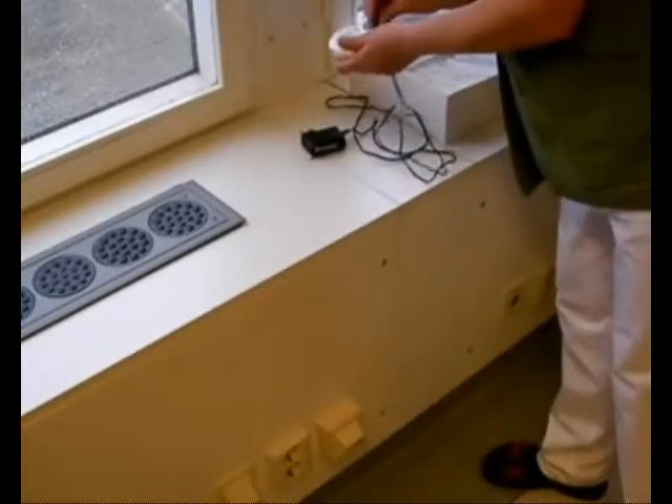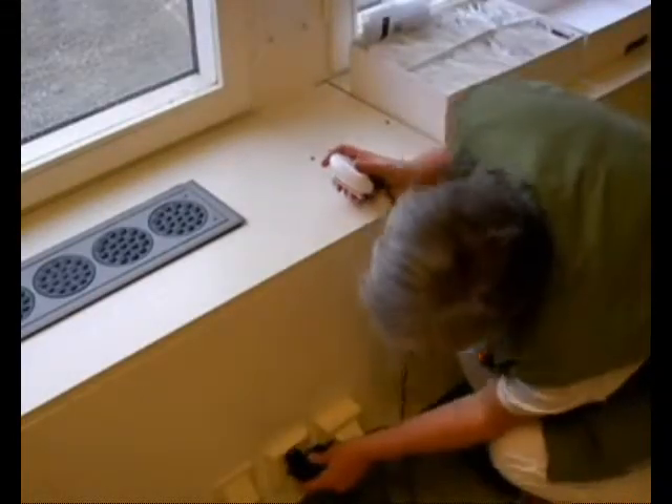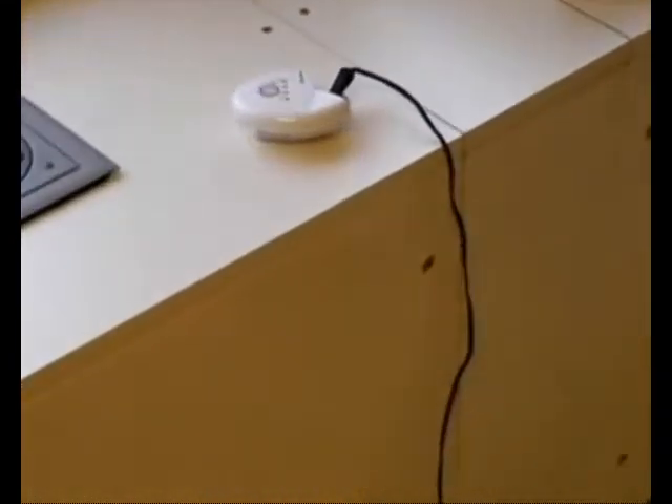The battery must only be charged when the alarm unit is not in use and not attached to a patient. A fully charged battery lasts 15 to 20 hours, meaning that it is advisable to charge the battery every night after use. Connect the charger to the alarm unit using a cable.